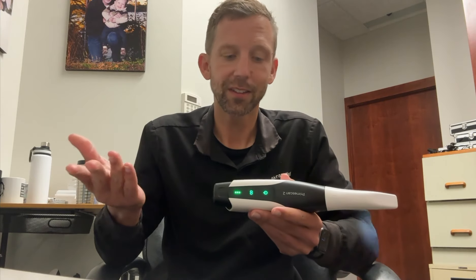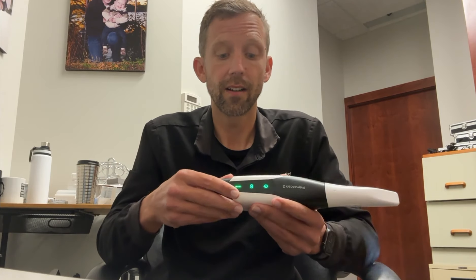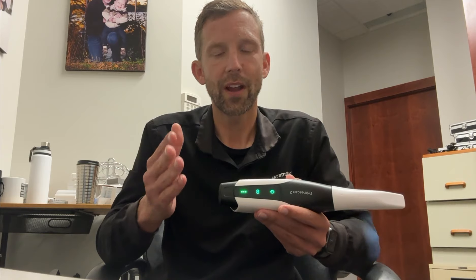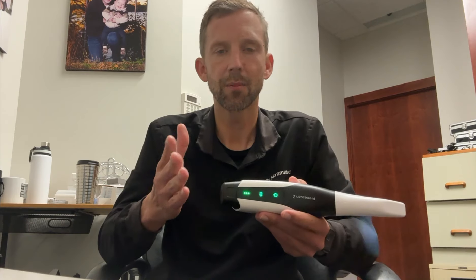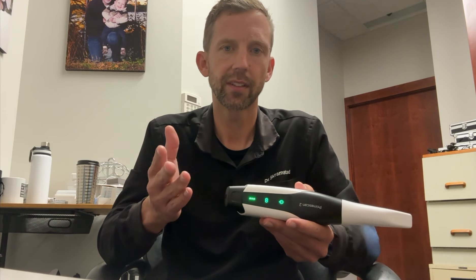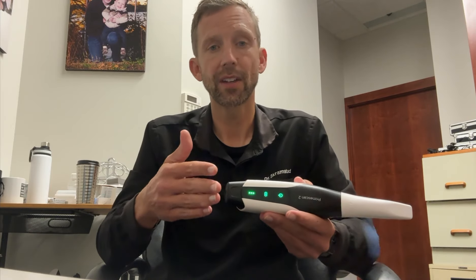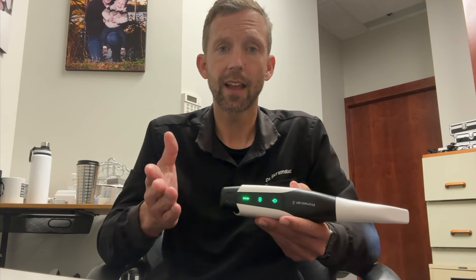Now we know this is wireless and wireless is great, we've all been waiting for it, but there are other wireless scanners on the market. I have a Trios 5 in my office — great scanner, love the scanner — but it needs a laptop. I don't think people realize how needing that laptop is a little bit of a cumbrance to efficiency. You can go room to room, but you have to connect it through Splashtop. It just gets a little bit cumbersome, and I've been using it less and less, quite honestly, since I've had the PrimeScan 2.